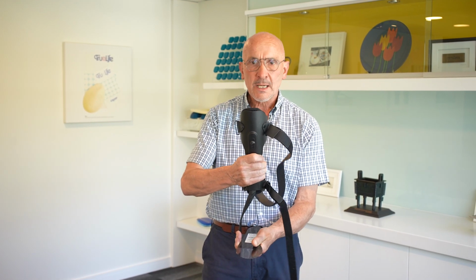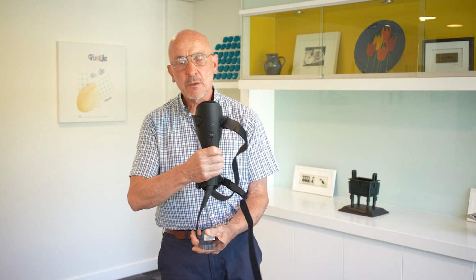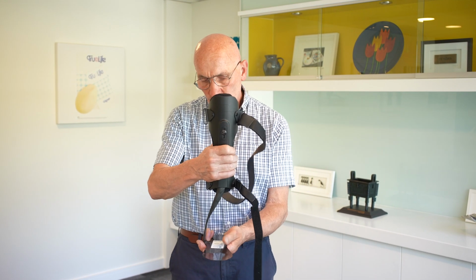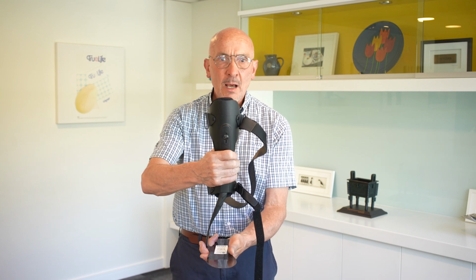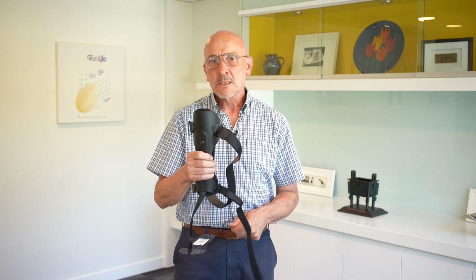The other added bonus of the strut and the dynamics of the brace is that it will provide mediolateral stability around the ankle, because often with drop foot you have lost the same stabilizing groups around the ankle itself that intrinsically provide that support. So as well as the tib anterior power loss, you've lost some stability around the hindfoot control. So the patient would tend to be unsteady in their gait and as such a little bit less stable.